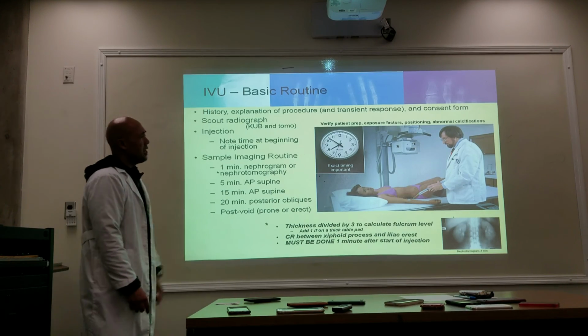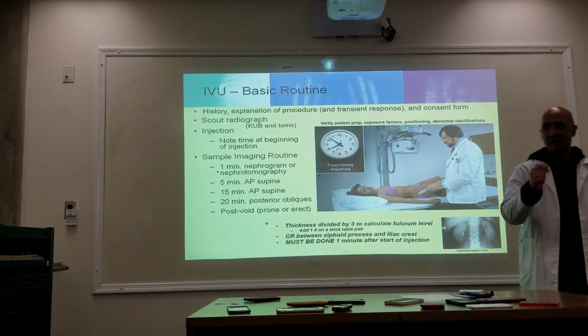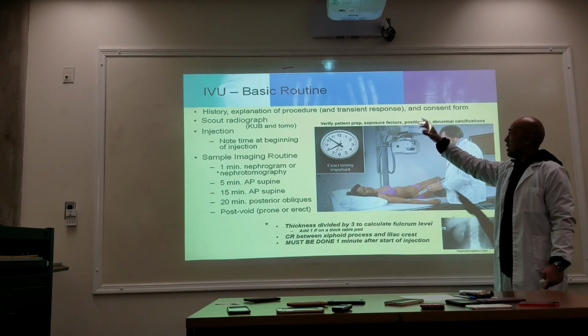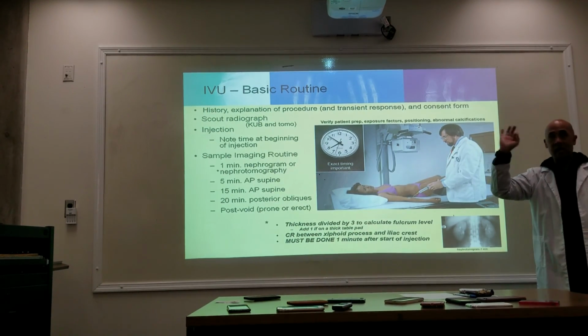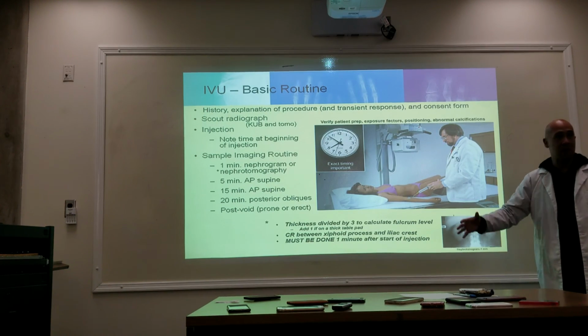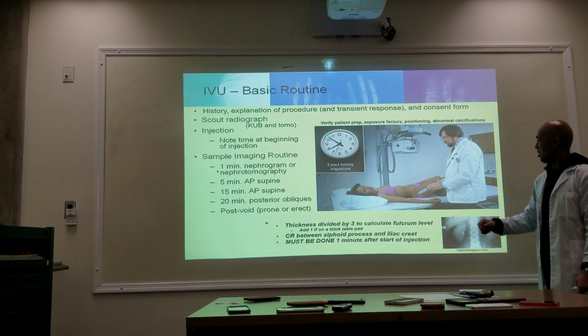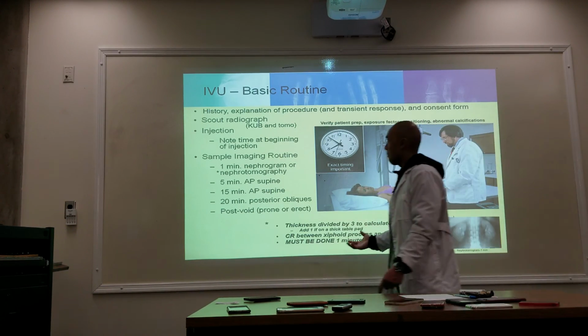And then before you do that, you're going to set up your room. Because of its time sequence, you want to make sure that you've selected your technical parameters, your kV is set, your mA is set, everything is set because it's quick. Make sure you have all your positioning sponges, things of that nature.